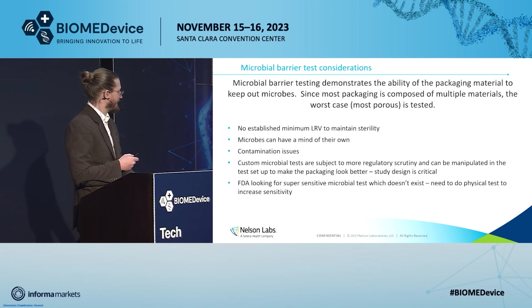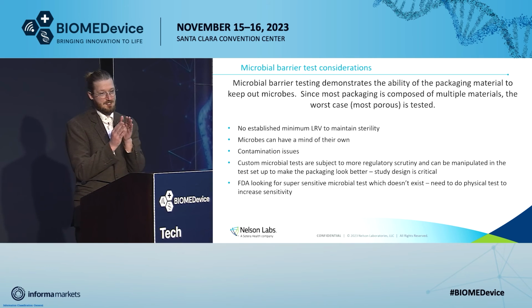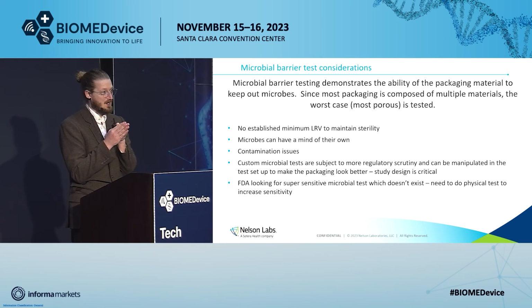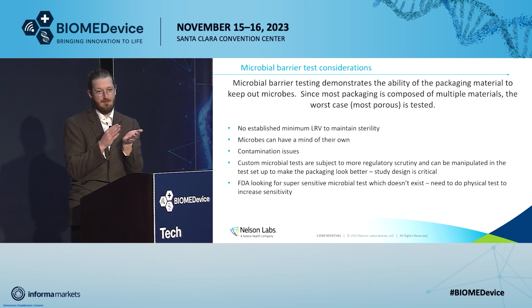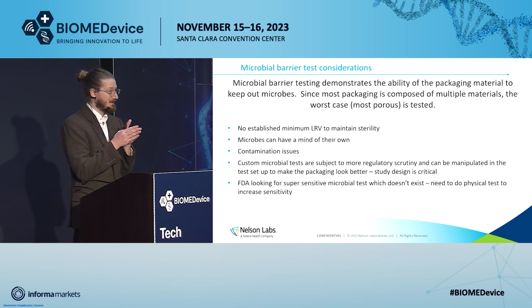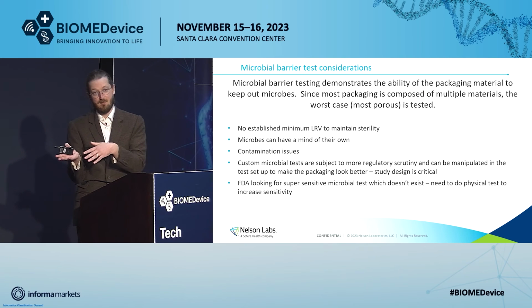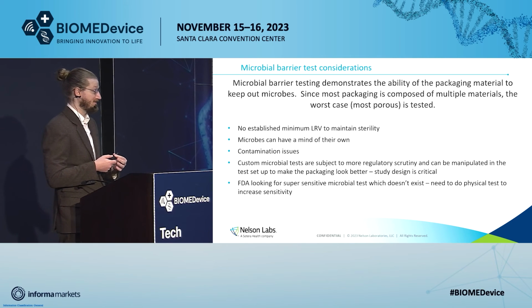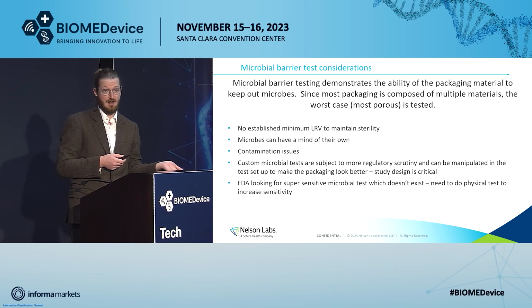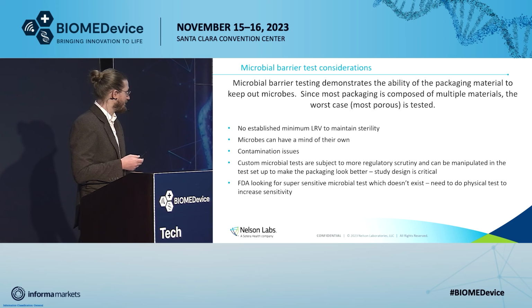Next are microbial barrier tests. So these are meant to show that your barrier is good at keeping microbes out, right? And if you have these combination systems where you say it's a poly pouch with a porous, like Tyvek, side to it, you'll want to test the worst case scenario, which is the porous side, right? These tests are kind of prone to contamination issues because, once again, it's dependent on the operator, and microbes kind of like to have a mind of their own sometimes, as we're well aware of.